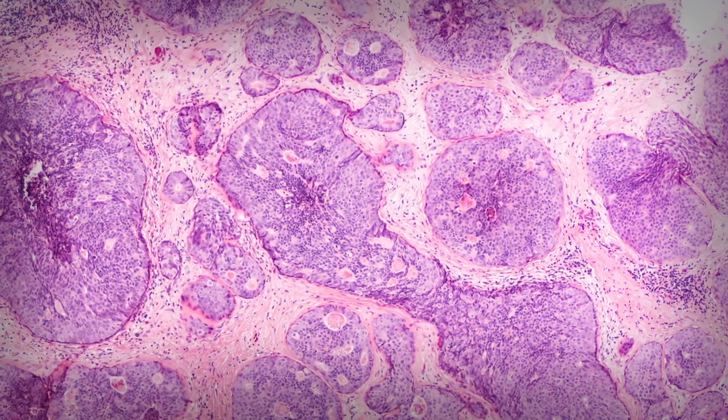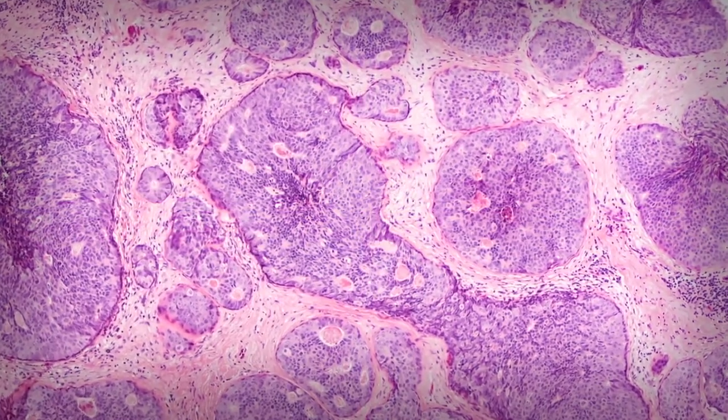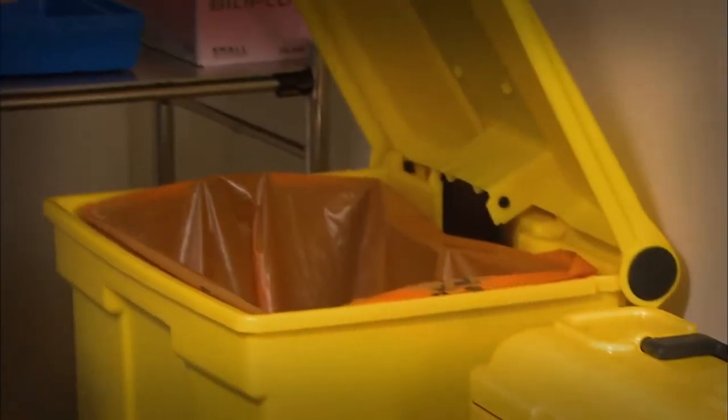The tumor may then be x-rayed to check the location of the MOLLE marker and further verify the margins. The tumor is then taken to the pathology lab. Because the magnetic MOLLE marker is not radioactive, it can easily be removed from the tumor and disposed of as biological waste with no risk to staff.